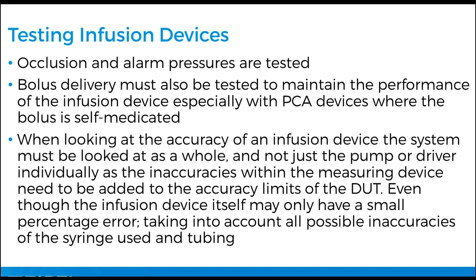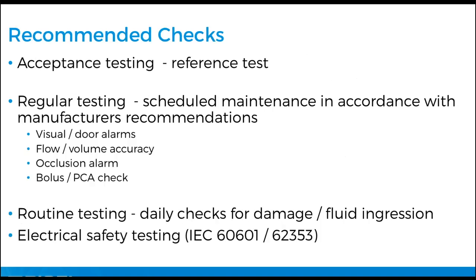consider the effects that the tubing has, and the methodology of testing. It can be considered that it would be better to have it in laboratory conditions to get the best accuracy, because flow can change. I could do the same setup twice, and there could be a little kink in the cable or an air bubble, and that can have an effect on overall accuracy. So it's important to look at these things when considering testing infusion devices.